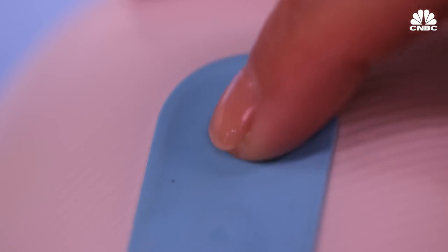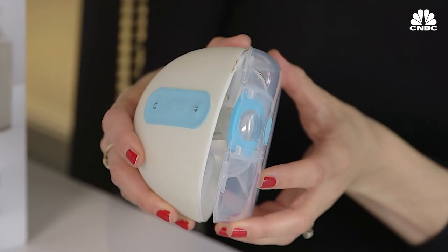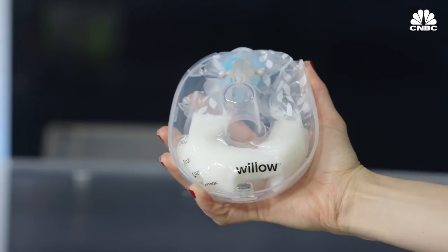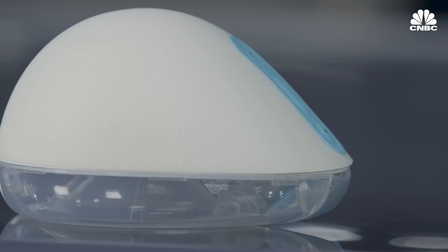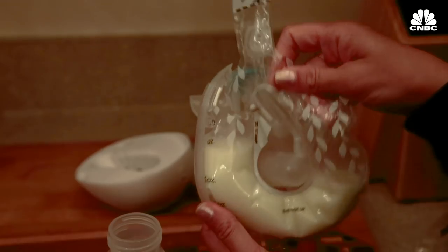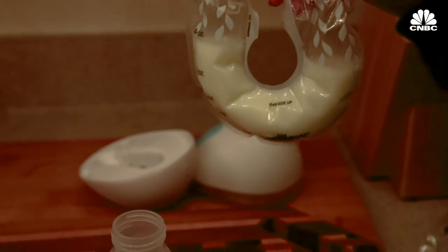Unfortunately, if you have an original Willow, you cannot use the new flange with the older pump. And you still need the expensive bags in order to use the pump. I hope eventually the company comes out with a version that doesn't require the bags, even though they are quite convenient when you're on the go.